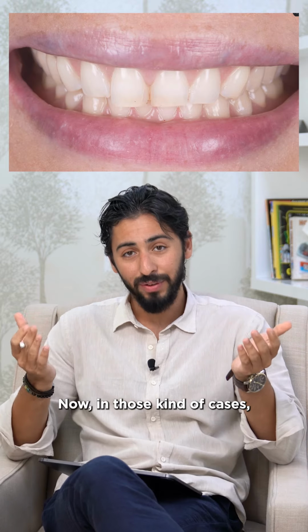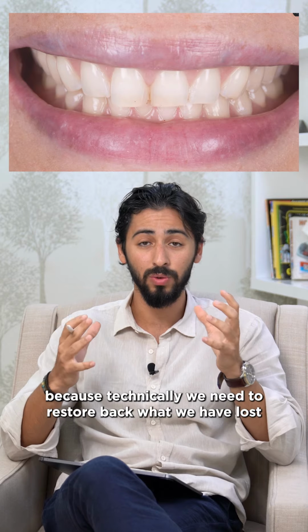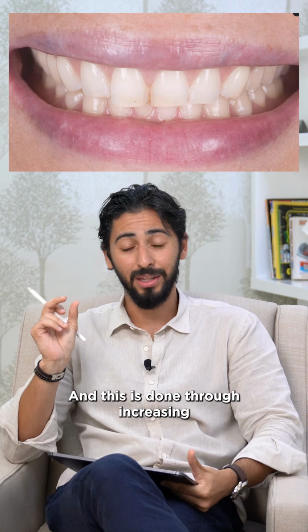Now, in those kinds of cases, we can go for a Prepless veneer because technically we need to restore back what we have lost during the years. And this is done through increasing the volume of the veneers.